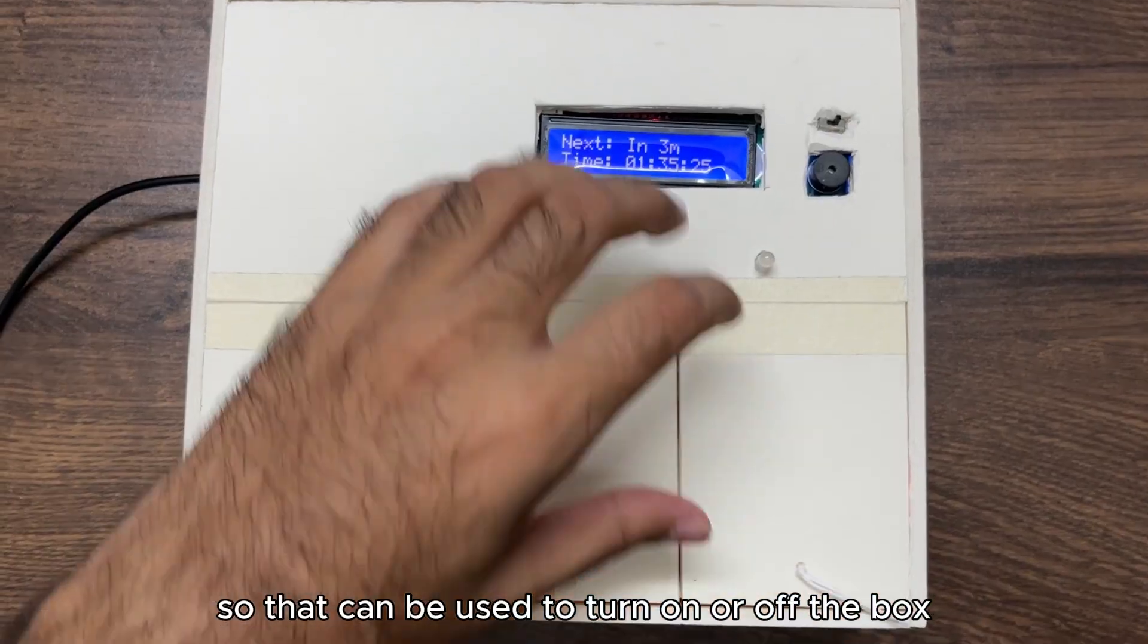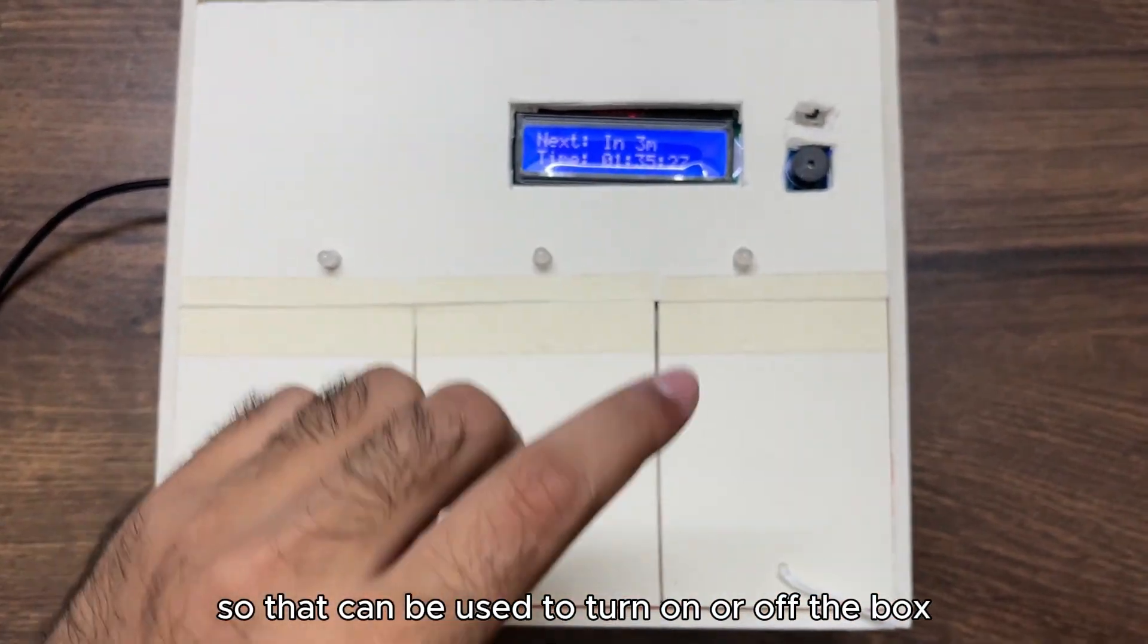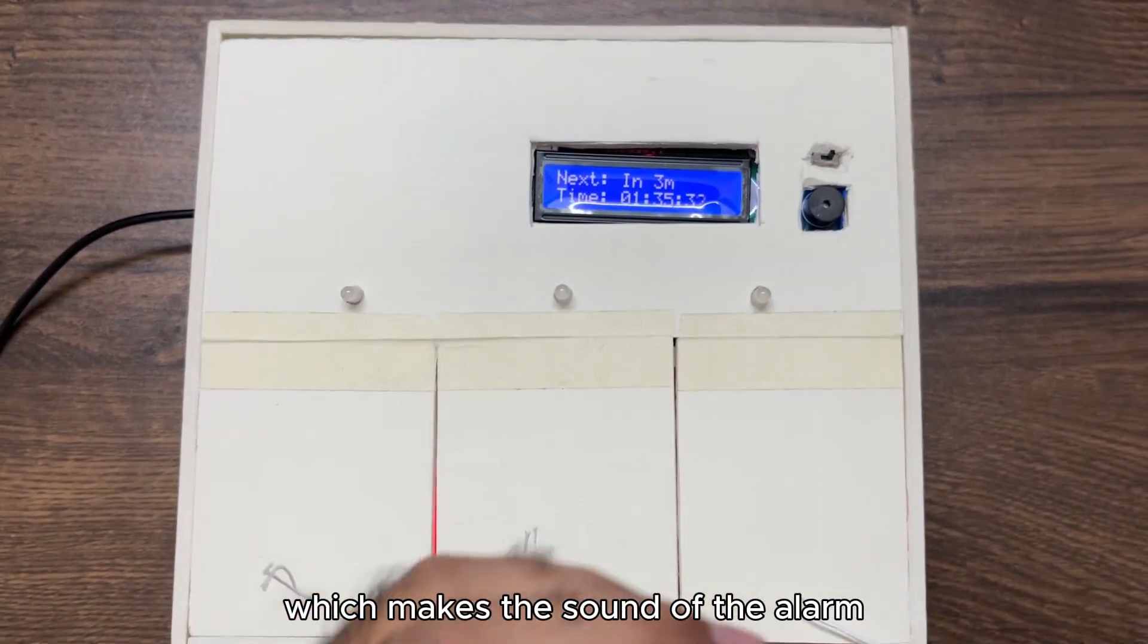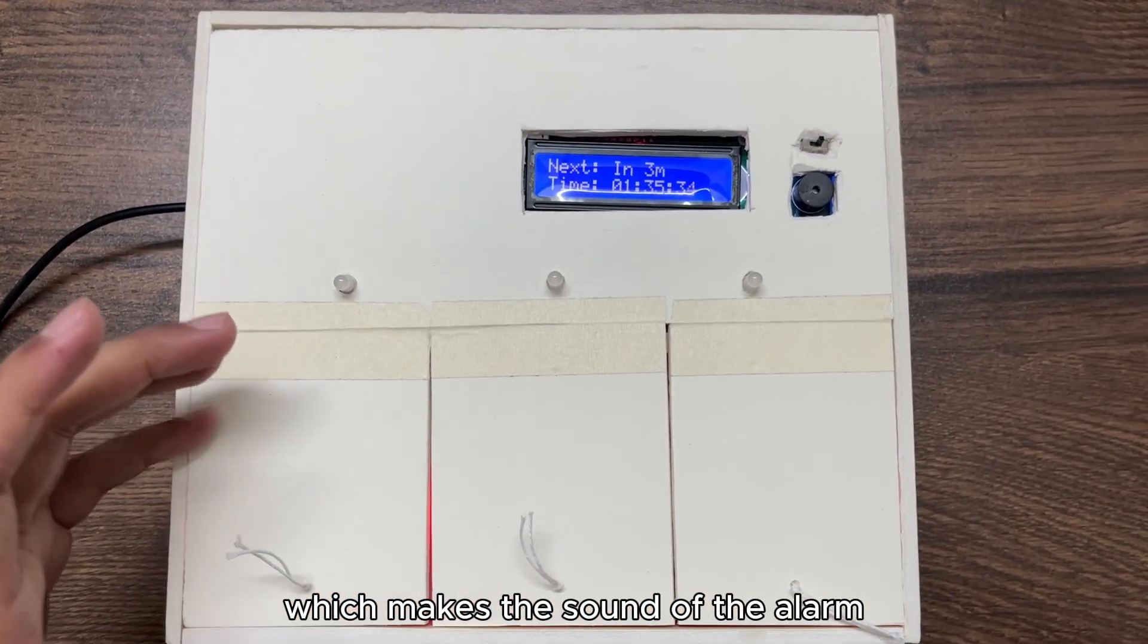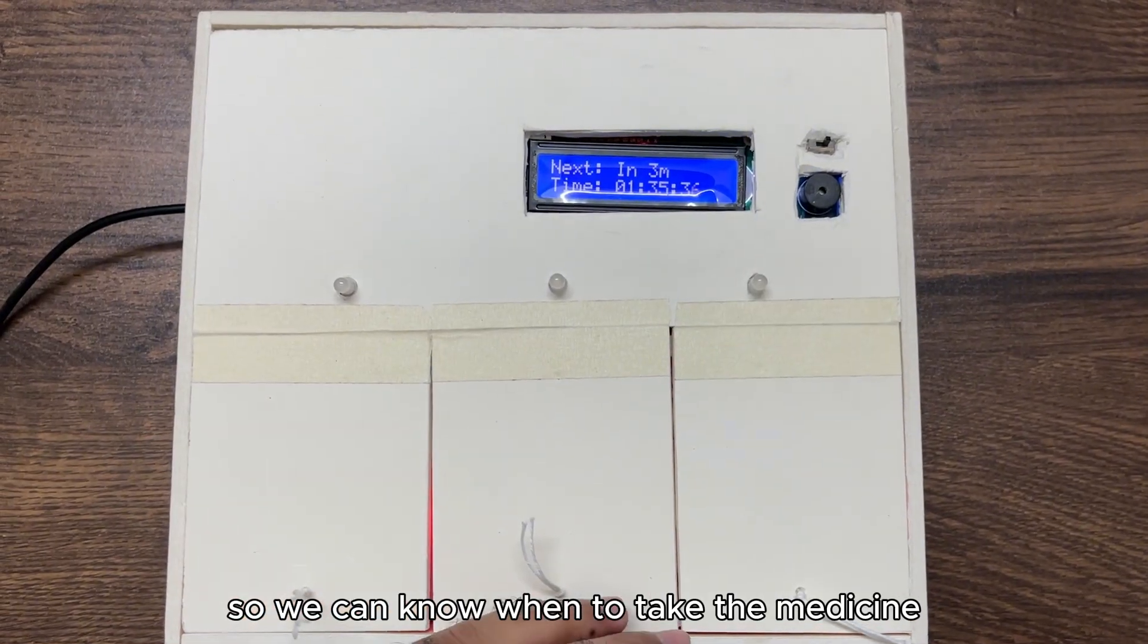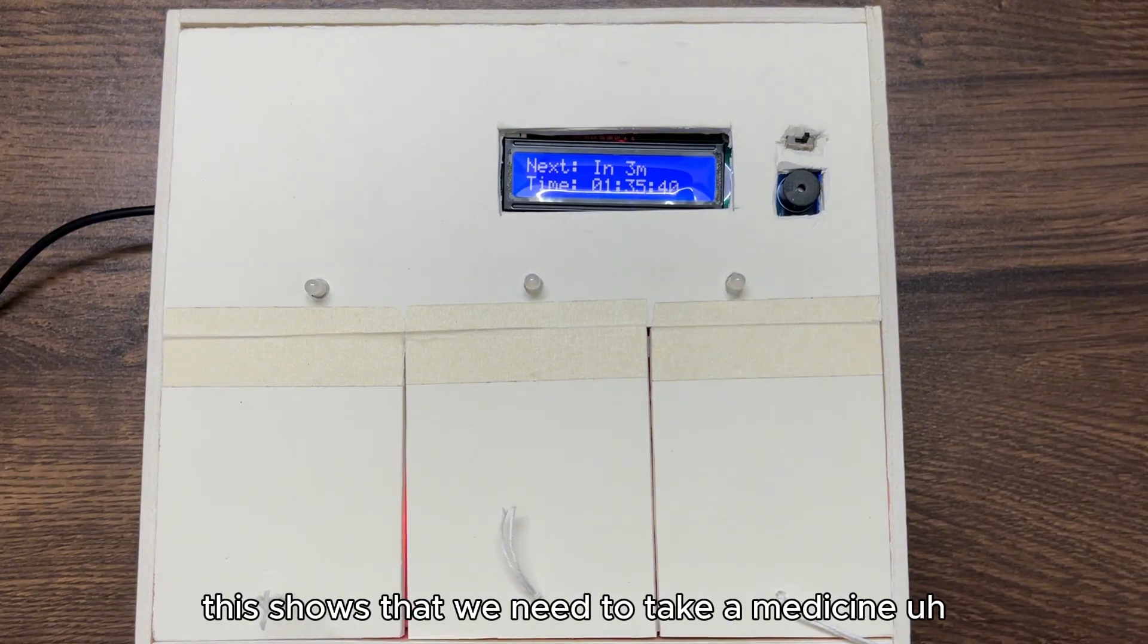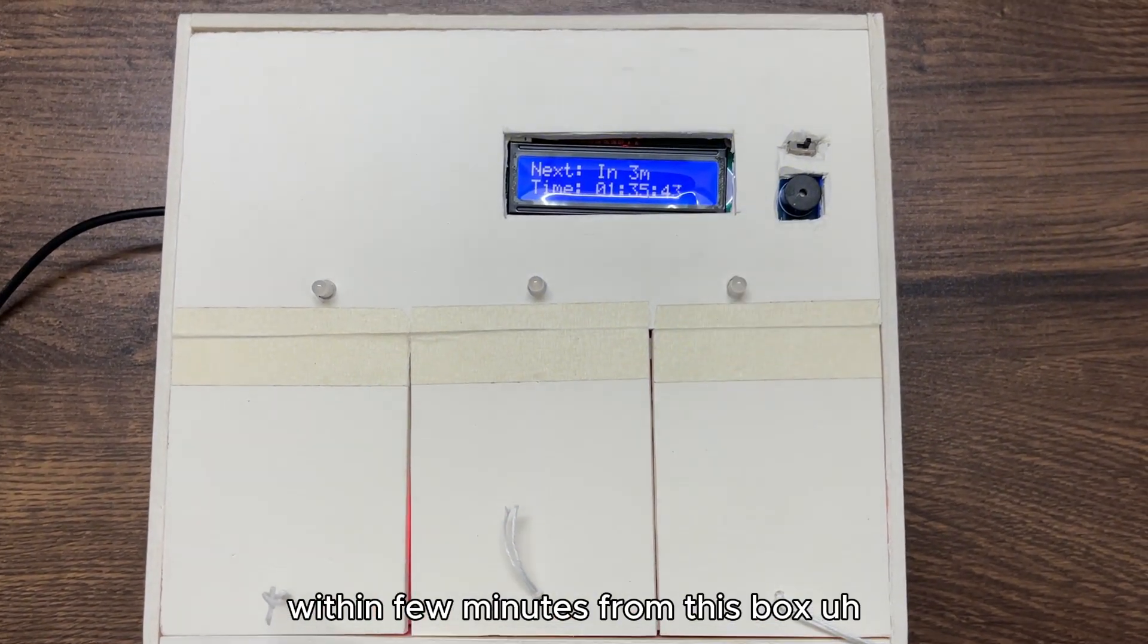The battery can be used to power the box. We can see here a buzzer which makes the sound of the alarm so we can know when to take the medicine. As we can see, the blue light is blinking. This shows that we need to take medicine within few minutes from this box.